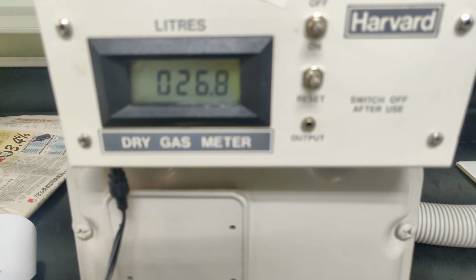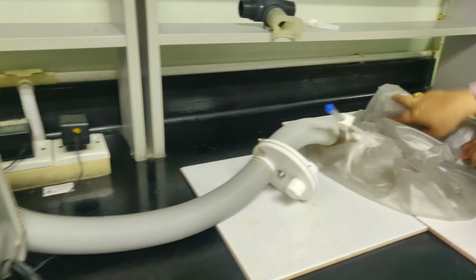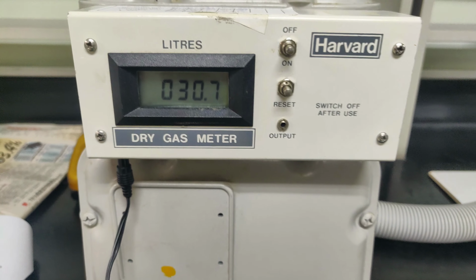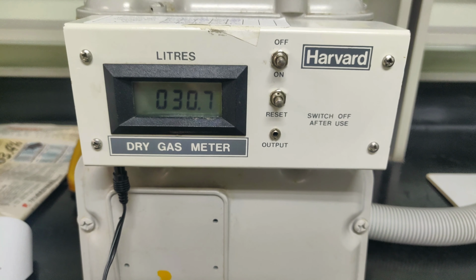What you want to record is the total volume of expired air after 3 minutes. So you need to keep pressing the bag until it's totally empty. Okay, now we can get the total volume of expired air for 3 minutes. This is for the first activity, which is the normal breathing.